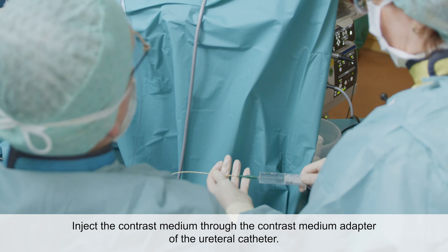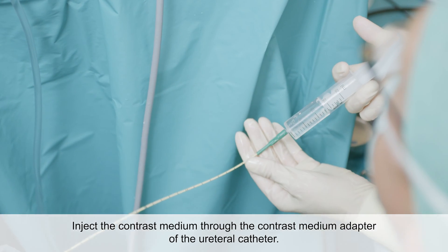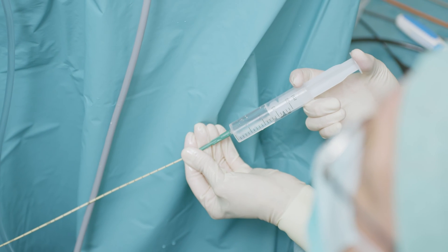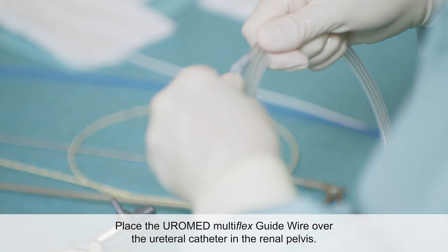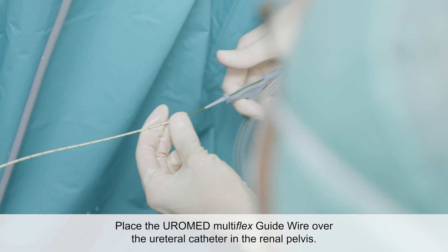The contrast medium adapter is then attached to the ureteral catheter, and the contrast medium is instilled into the ureter, all the way into the kidney. This is followed by an X-ray inspection of the ureter and the kidney. The Uromed Multi-Flex Guidewire is placed over the centrally open ureteral catheter.